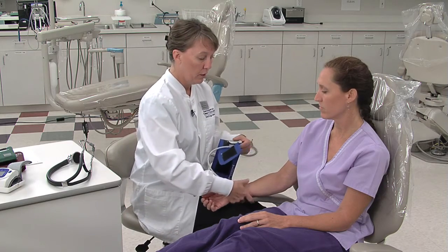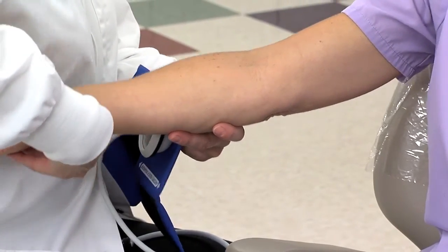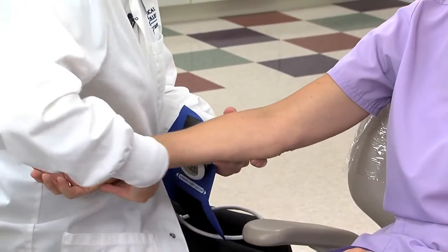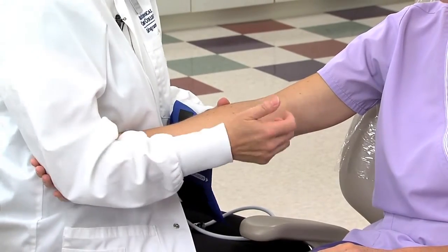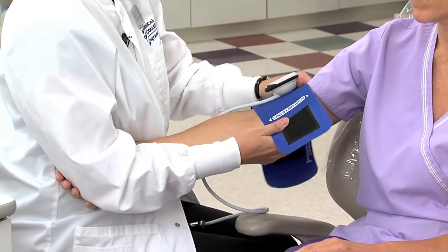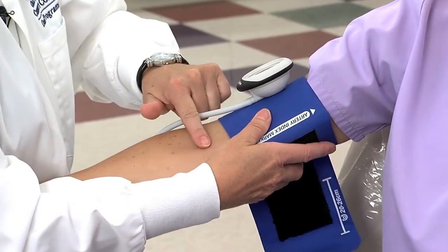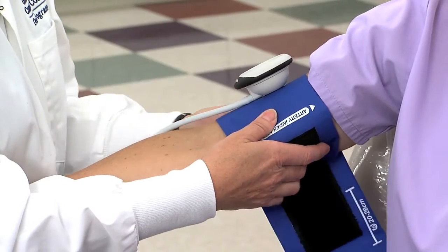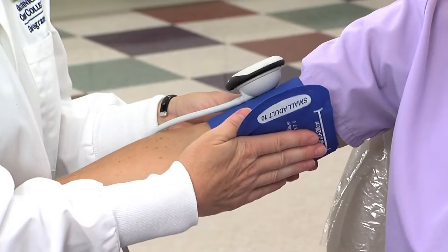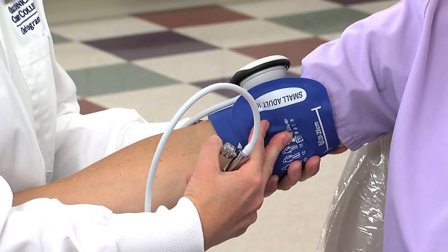When we place the cuff, we want the patient's arm extended out, and we want to place it down to our side. Never place the patient's hand in your armpit or let their hand fall into your lap. You always want to have it guided right at your elbow. Almost the palm of their hand is at your elbow. You will then align the cuff with the artery of the arm, approximately an inch above the antecubital area. And you want to make sure that the cuff is nice and straight. Always make sure that the air has been expelled from the cuff before placing it on the arm.